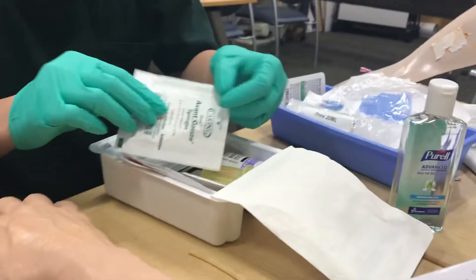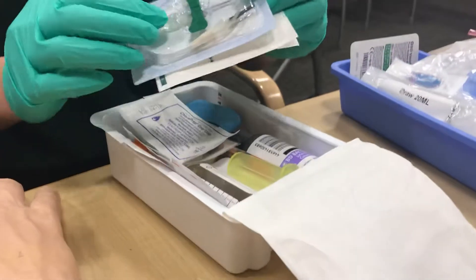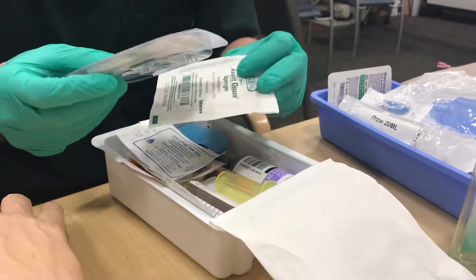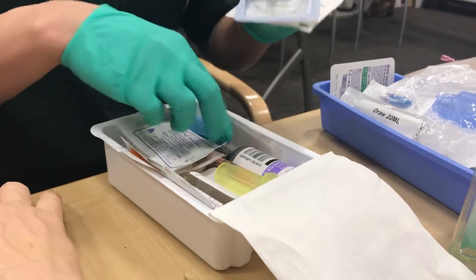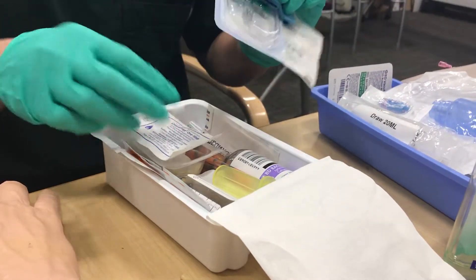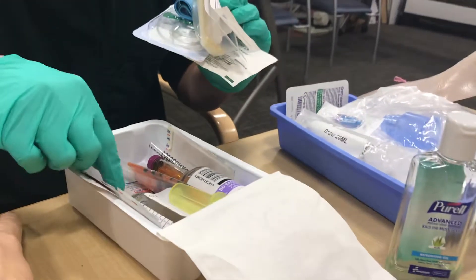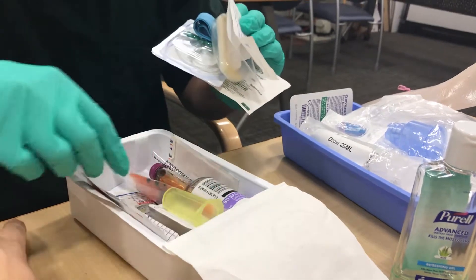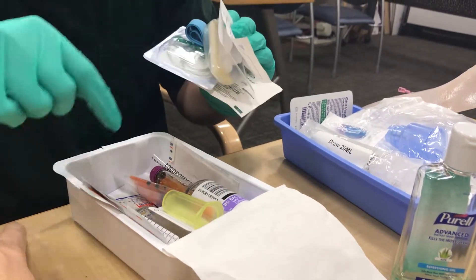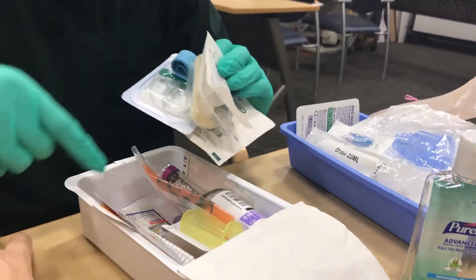Inside the kit there's a small 2x2 gauze, a vacutainer for blood collection, a tourniquet, some alcohol pads, the actual blood culture bottles, an adapter to connect the vacutainer directly to the bottles, a bag, and usually another set of gloves all the way at the bottom.